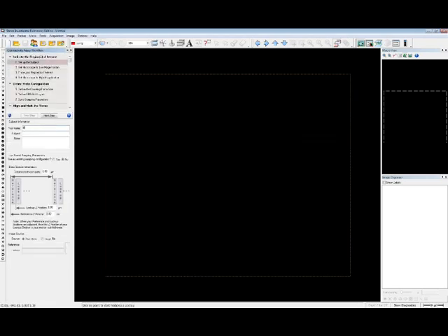At this point, we have an opportunity to write down the name of the person doing the work, and perhaps any notes on this particular subject or animal. If we had parameters saved from a previous experiment, we could upload and work with them, but we'll actually do ours from scratch. We can put in the distance between the pairs of sections that we have. We're also going to put in the reference and lookup positions, which is really the thickness of the sections. So we start from 0 microns and go to 5 microns for the reference, and the lookup is going to be 5 to 10.